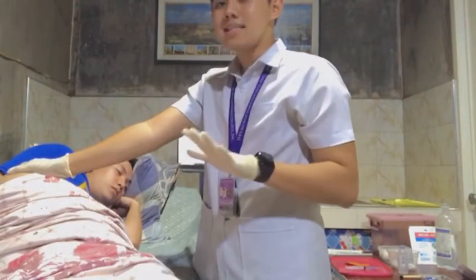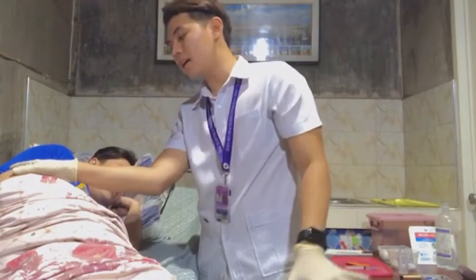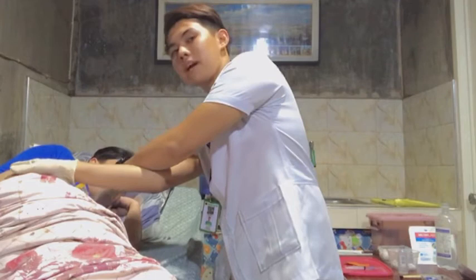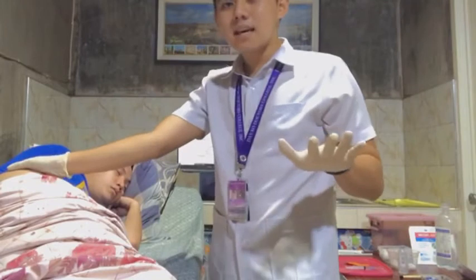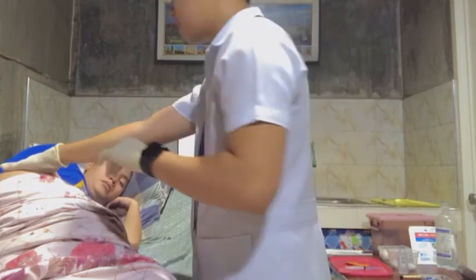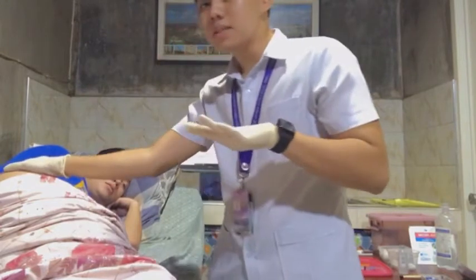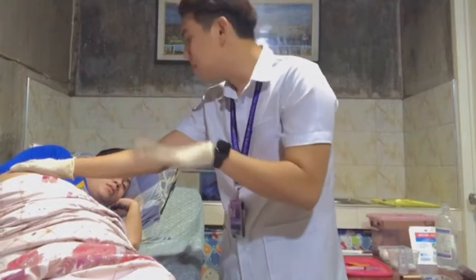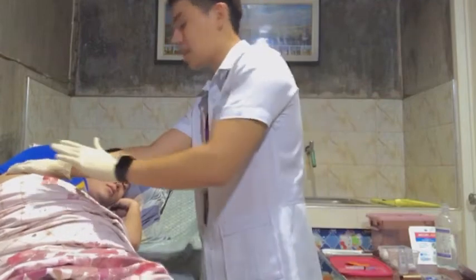And then point the index finger to the anterior superior iliac spine. As you can see here, my index finger is located at the anterior superior iliac spine of the patient. We need to extend the middle finger back along the iliac crest toward the buttocks. As you can see here, I have formed a V shape. The index finger, the middle finger, and the iliac crest form a V-shaped triangle, and the injection site is the center of the triangle.